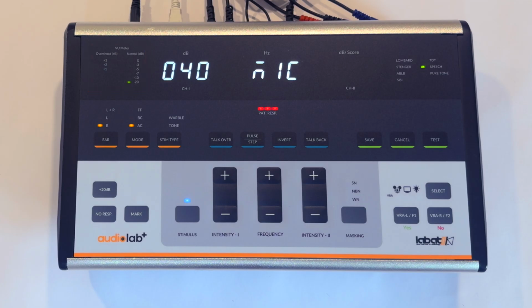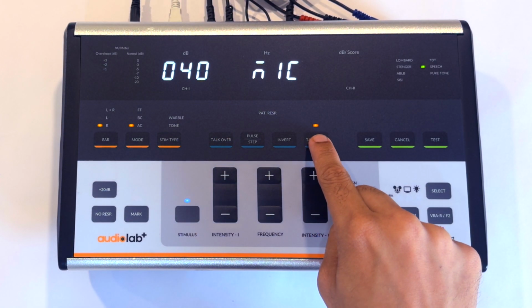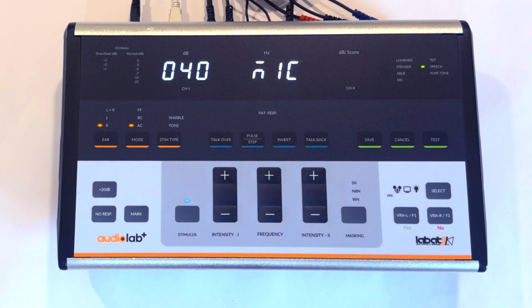The audiologist will use a talkover mic to present speech and a talkback mic to hear the patient's responses. As the patient responds, record the response and note down the speech score for the selected intensity. Repeat this process to record speech scores across all required intensity levels. Once completed, press the stimulus key again to turn off the test.